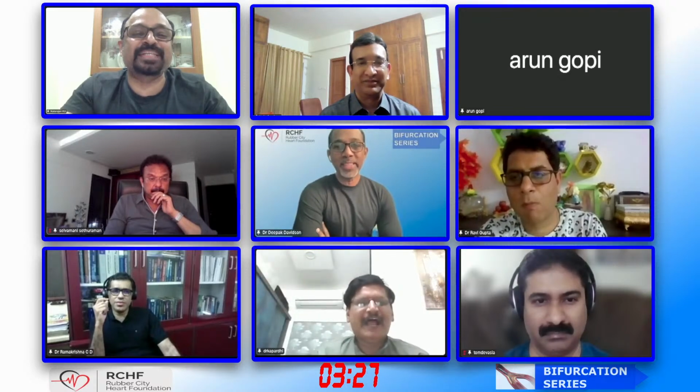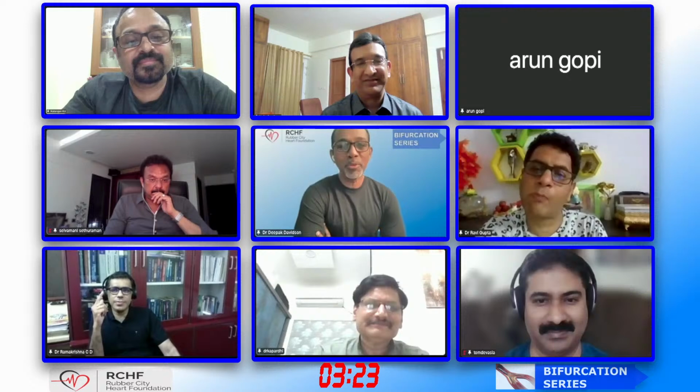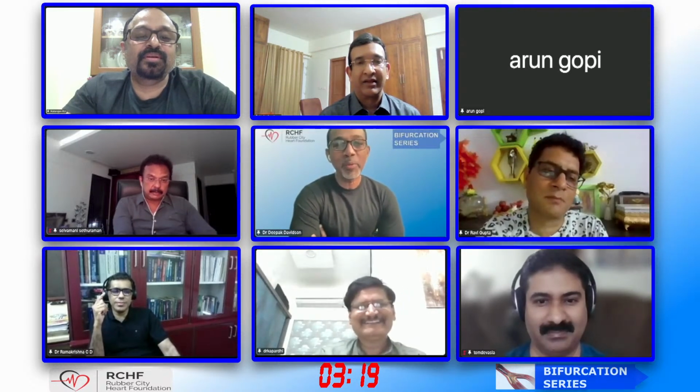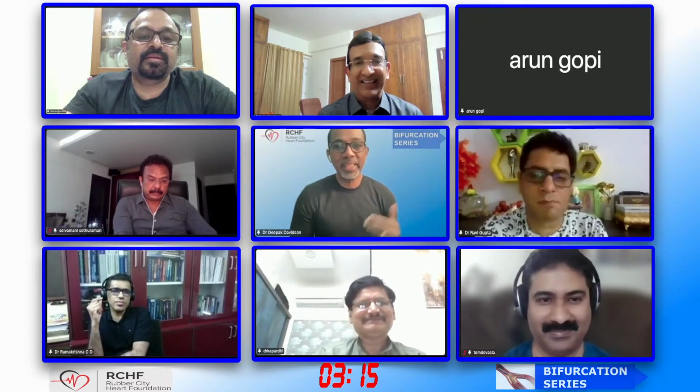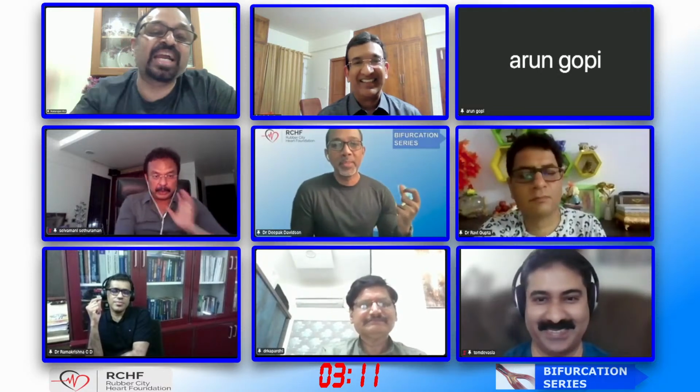My question is just a matter of semantics. So my question is, why would somebody want to do that reverse crush? You can just straight away stop with doing a TAP, isn't it? Rather than making things more complicated. What if the angle is 45 degrees? What if the angle is 45 degrees?